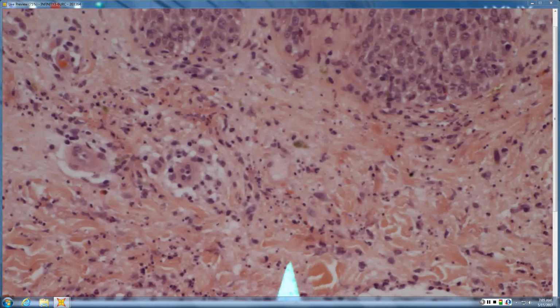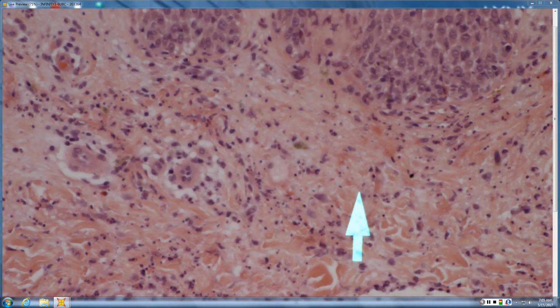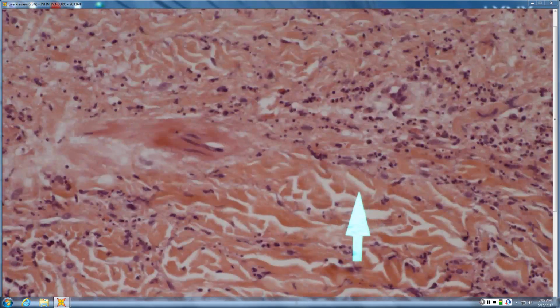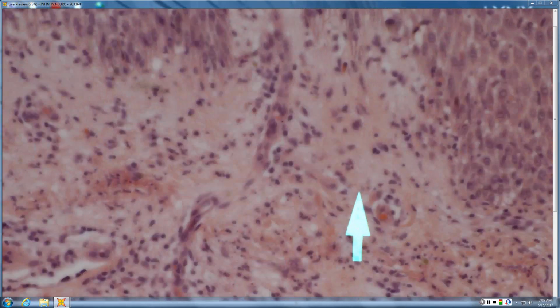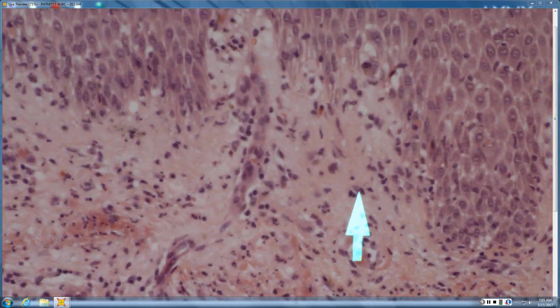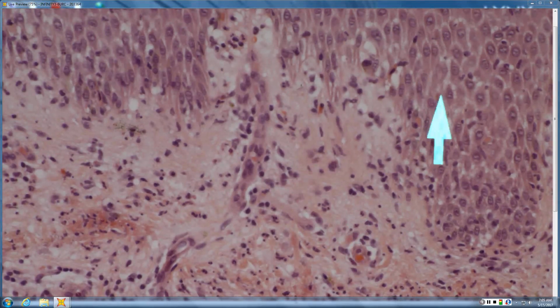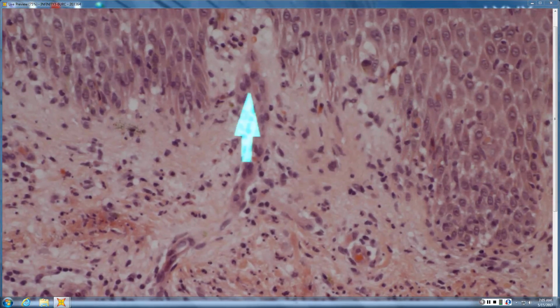But when you pair these things together, acute basket-weave horn, the interface, spongiotic, kind of chronic appearance though to the papillary dermis. There's eosinophils in here too. It definitely makes you think of drug, and then hopefully the history kind of helps you, or the picture of it being fixed drug. And I didn't mention, but there's all these apoptotic keratinocytes in here too, so that kind of helps to point towards drug.